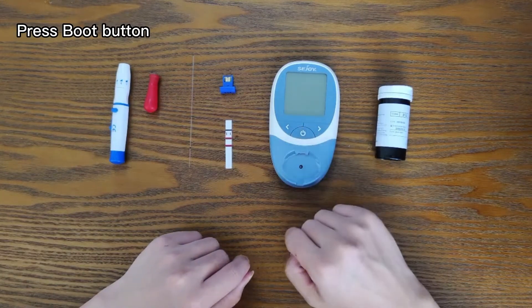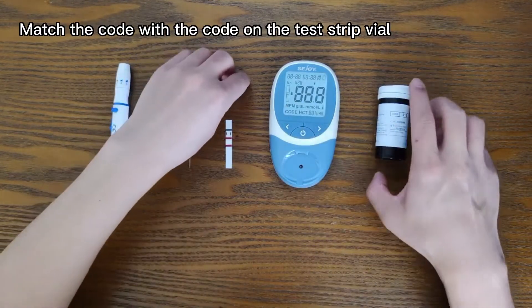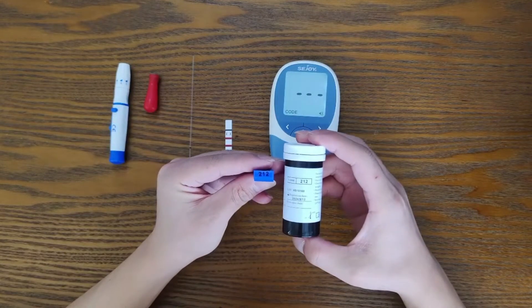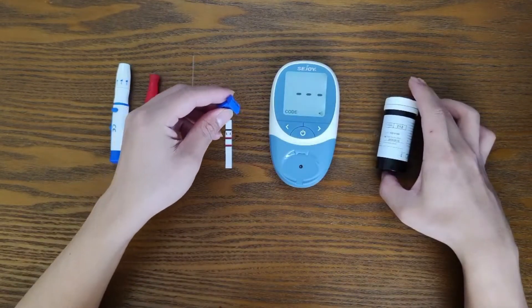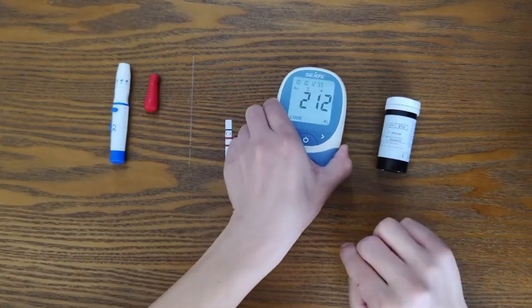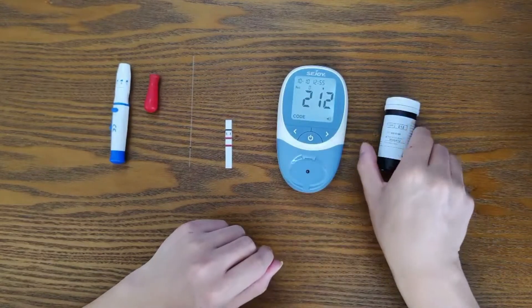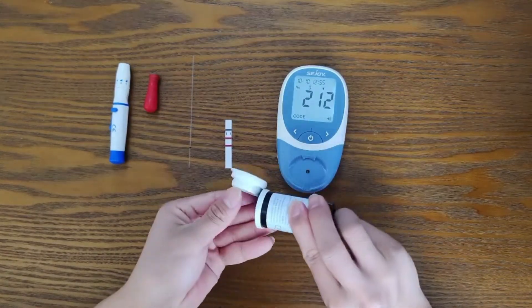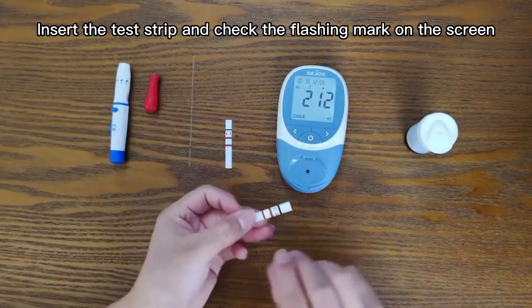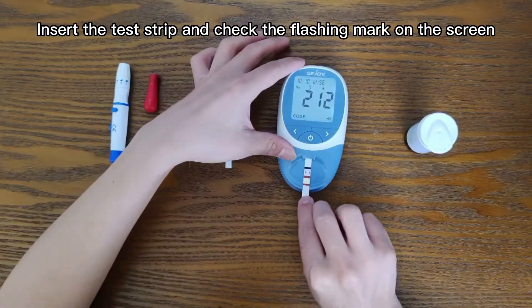Press the boot button. Match the code with the code on the test strip vial. Then put the code chip from the strip package into the chip port of the meter. Insert the test strip and check the flash mark on the screen.